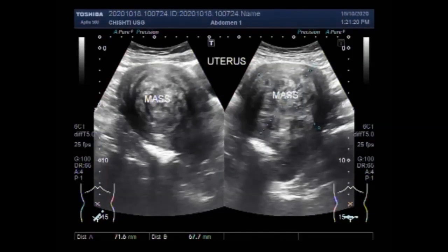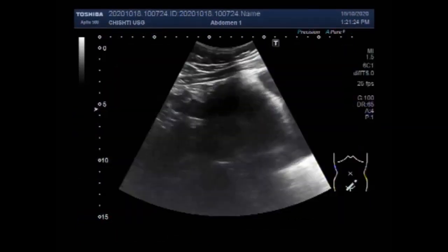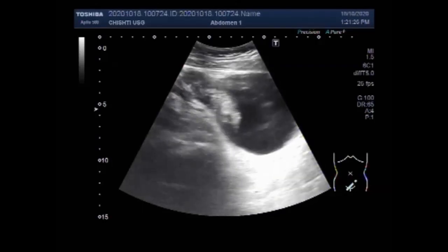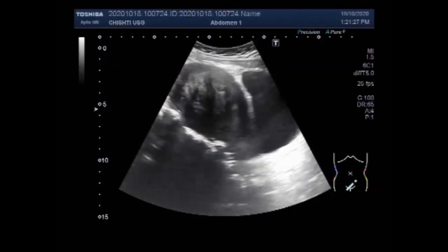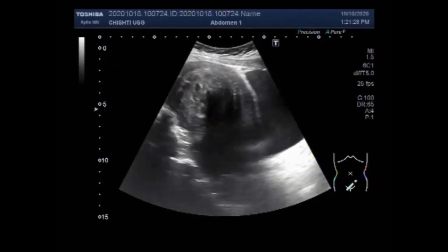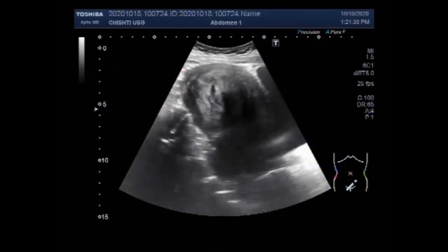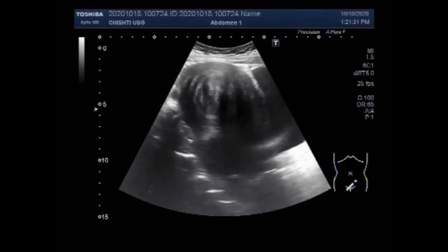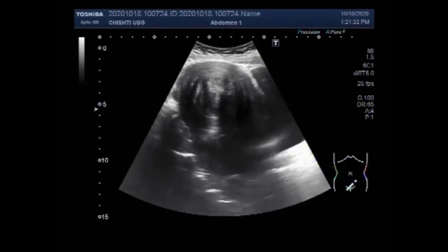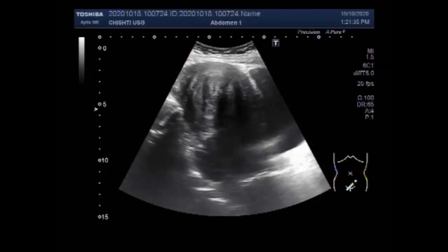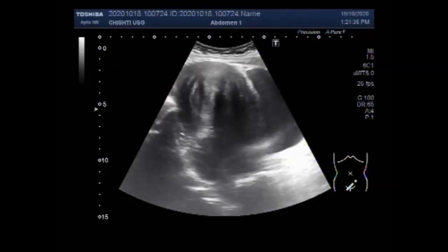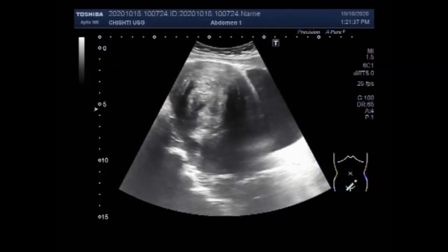Dear viewers, I hope you are all fine. This ultrasound video shows two cases of fibroid uterus. The first case shows a single large fibroid, while the second case will show multiple small fibroids.